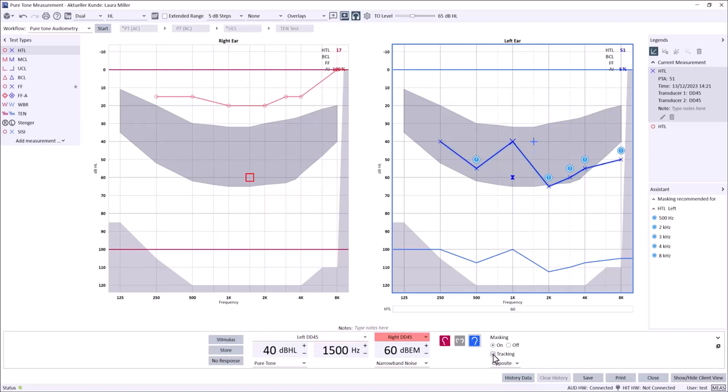To store masked responses, simply select store just as when storing unmasked responses. Once the assessment is complete, select save.